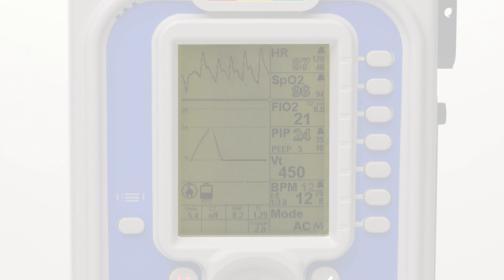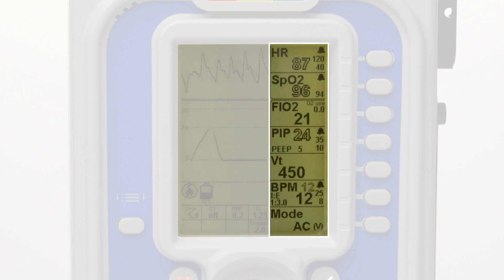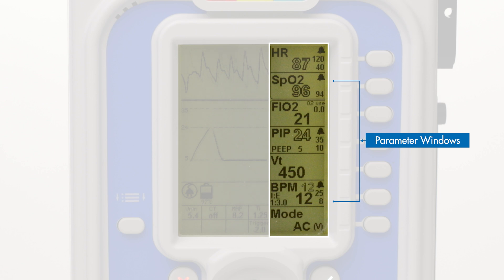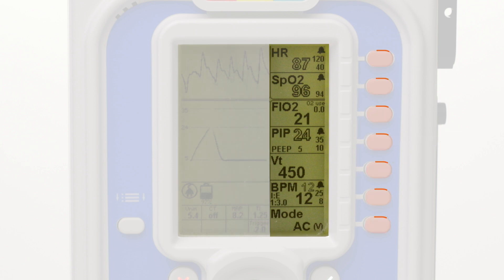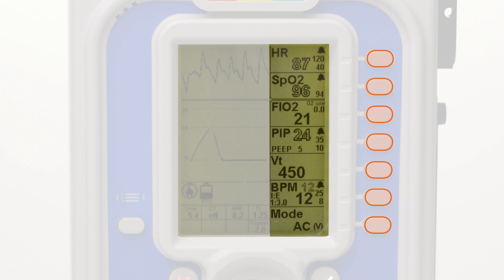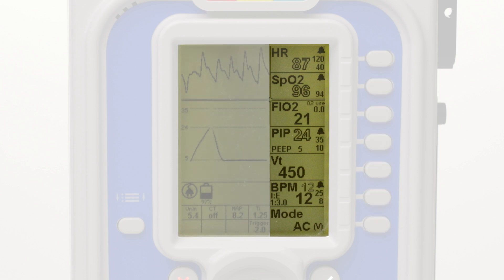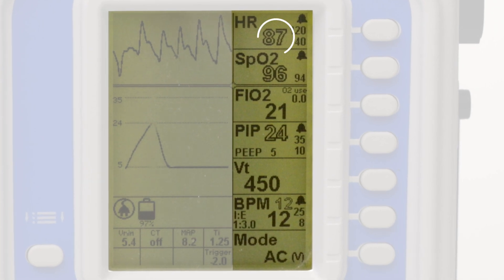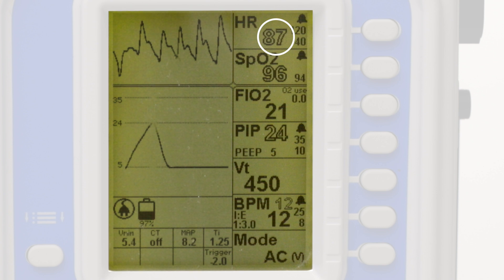Along the right side of the screen are the parameter windows. There are seven parameter windows in total. Each parameter has a corresponding button that is used to adjust specific settings within the window. Within each window, outlined text corresponds to monitoring readouts or calculated values that pertain to the specific parameter, such as heart rate or SpO2 level. Outlined text values cannot be changed.